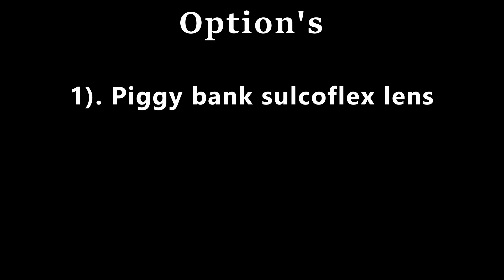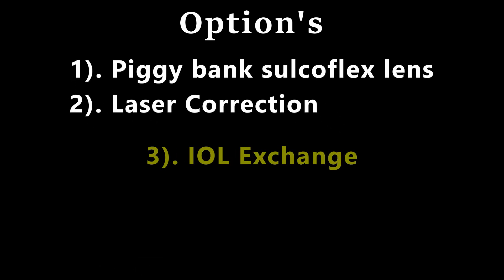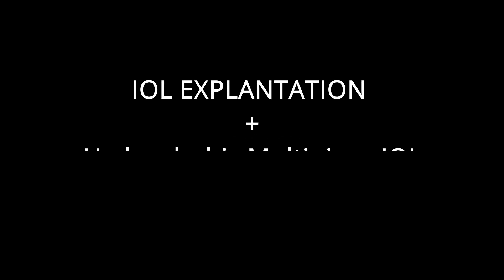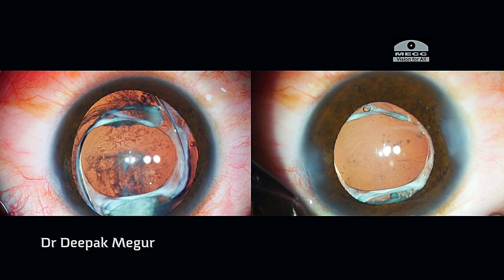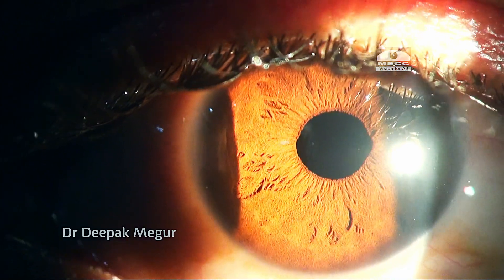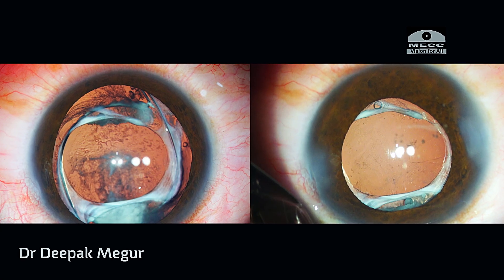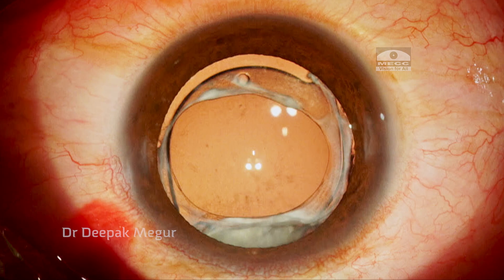Now how do I manage this? There are multiple options available including using a piggyback sulcoflex lens or laser correction. But I decided to go in with IOL exchange — to explant this lens and implant an appropriately powered hydrophobic acrylic lens. Explanting the PMMA IOL is a challenge since I had not explanted one in the past, although I had explanted quite a lot of foldable lenses. So one week after the posterior capsule polishing, I take up the patient for IOL exchange.